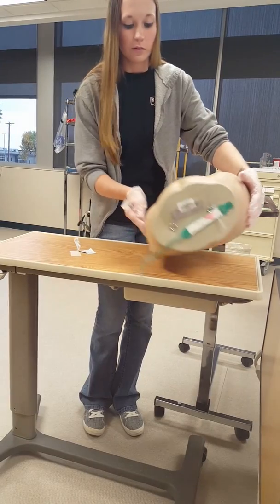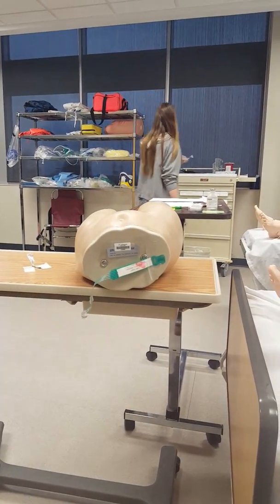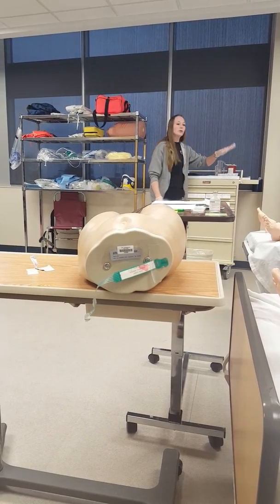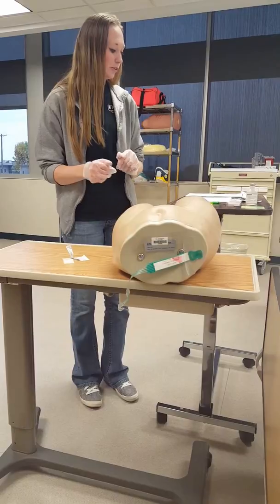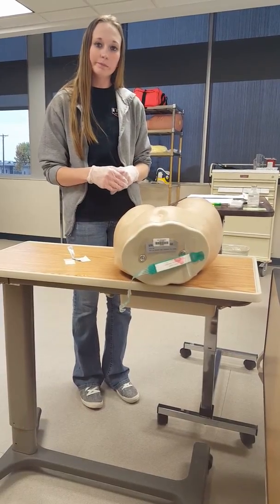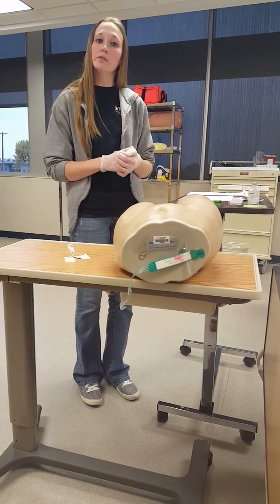And then I would lock my needle, and then I would put it in the disposable area. And then I would ask you if there's anything else I can do for you today. And I would document and take off my gloves and wash my hands.